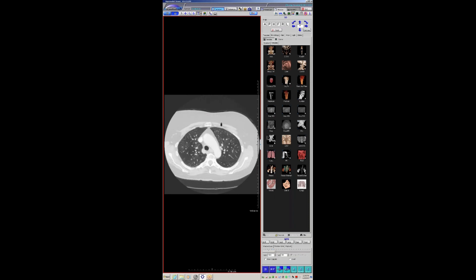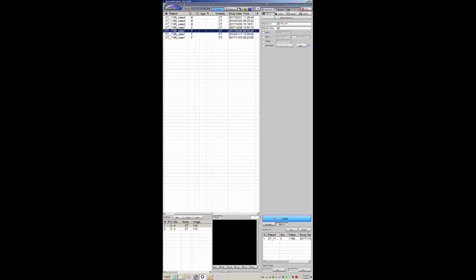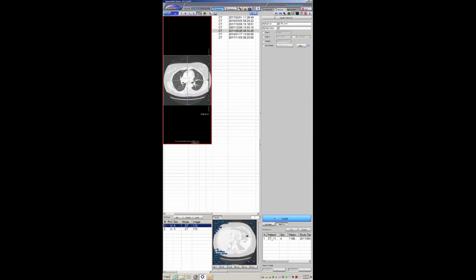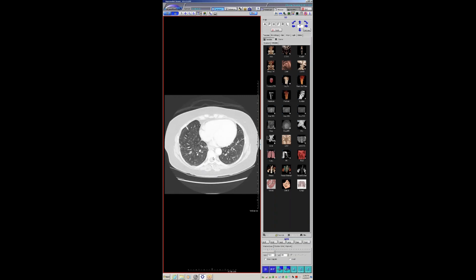I'm not going to lie, I just assumed this breast cancer was mets. Anyways, this time I was like, God, it kind of looks like DIPNECH. Went back to older studies. Sure enough, these nodules were there, but much smaller. But this was many, many years ago, and even going back into 2007.